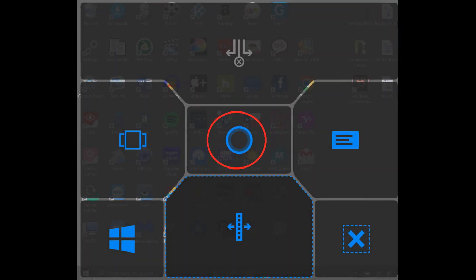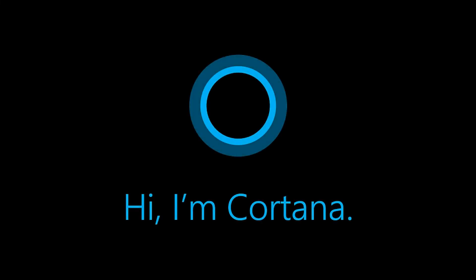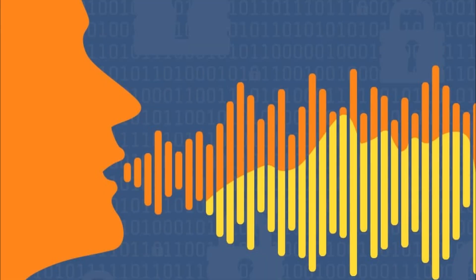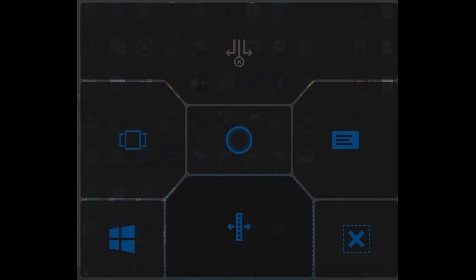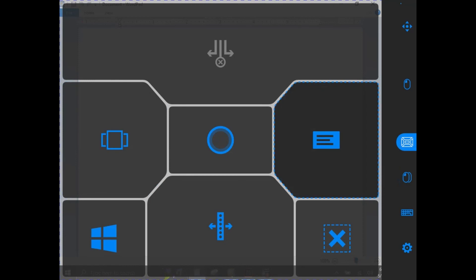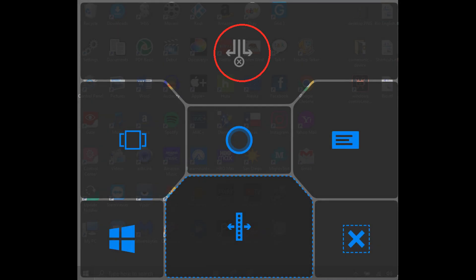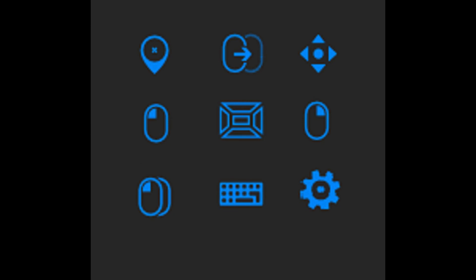The option in the center that looks like a circle is used to activate Cortana — equivalent to asking Alexa or Siri for help. It's a good feature if you have your voice. The upper right option, which looks like an envelope, opens the Windows notifications menu. These are all the options in the Windows Control toolbar.